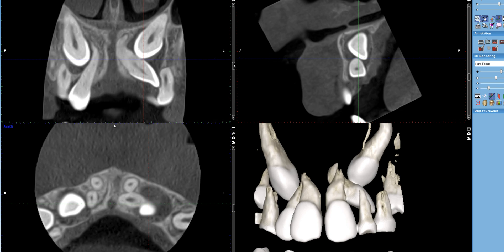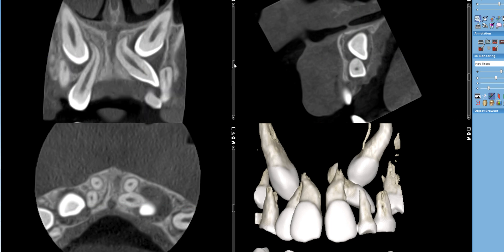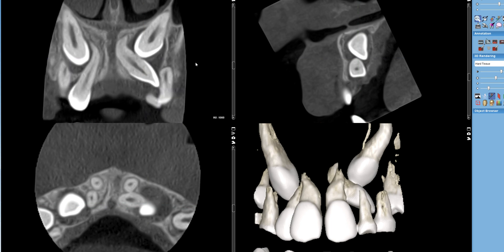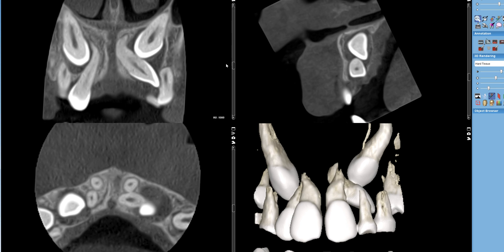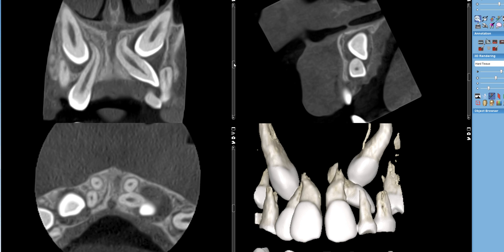One thing I mentioned is whether there's a presence of overt root resorption. The crown is definitely touching the lateral incisor in both cases, but I don't see overt resorption — the overall outline of the root looks normal. Perhaps there's minimal resorption, but by overt I mean there's no gross significant root resorption, which is a good sign for the patient. Thank you again and take care.